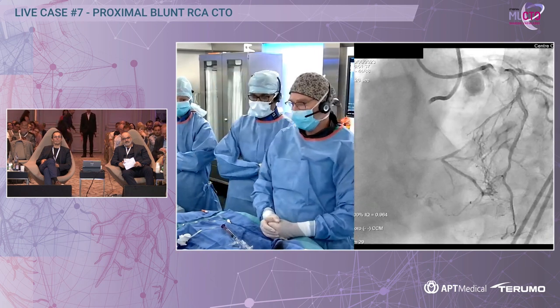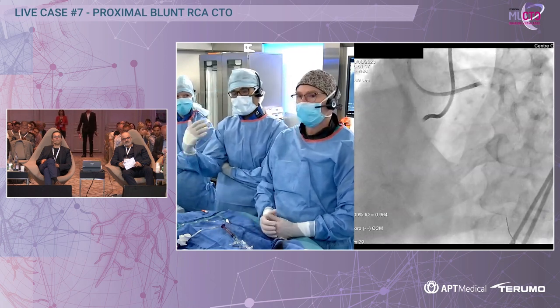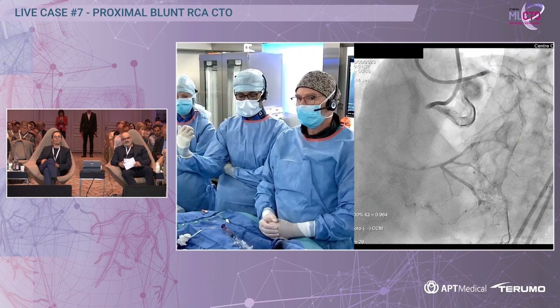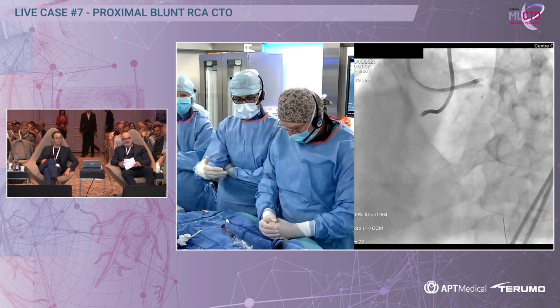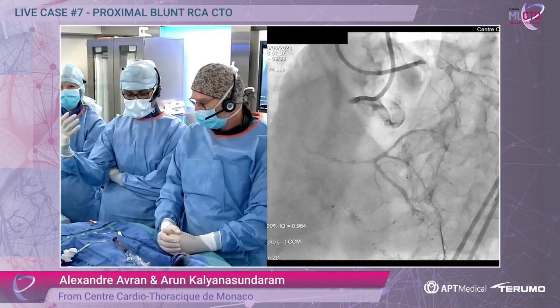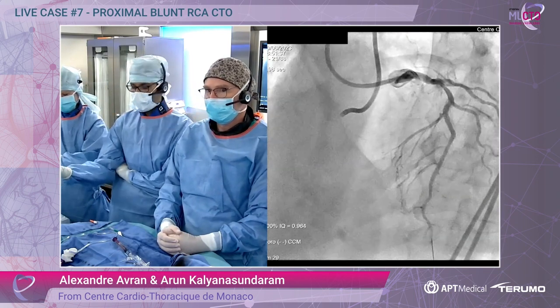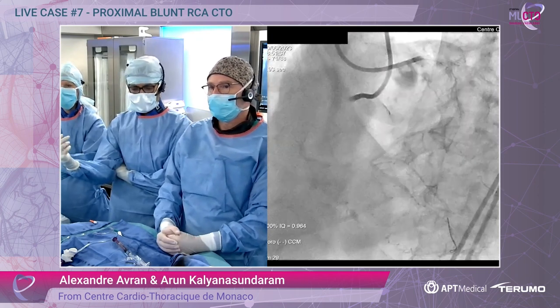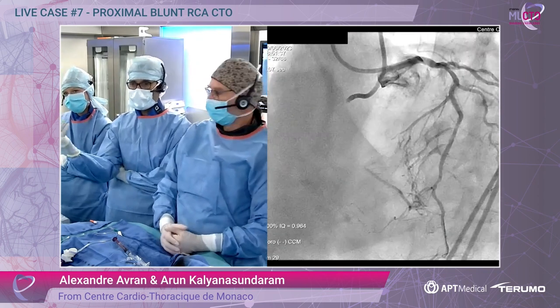We got a Gaia just with the guide and it backed everything out. So what we've done is put in a 6 French Expressman — a guide extension catheter with side holes — which I'm using for the first time. And an ELONG microcatheter, apparently we only have the 150 cm version, so we're using it antegrade. We have just managed to penetrate the proximal cap. That's where we are now.